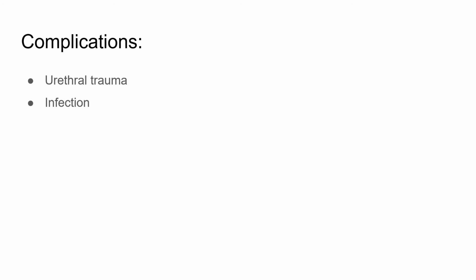So only if it is inevitable, then only it is performed. Why? Because it is a structure which is inserted into the system and stays there for a longer duration of time, there may be a chance that there will be urinary tract infection due to this particular catheter. So these are some of the complications.